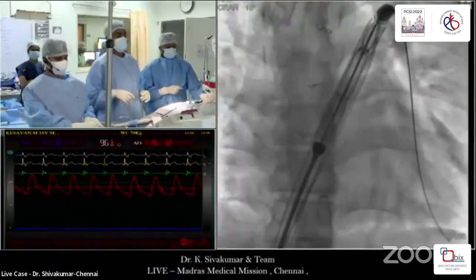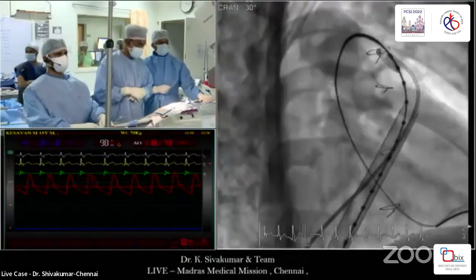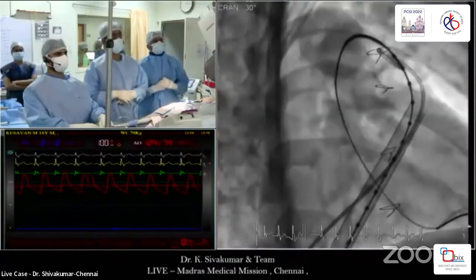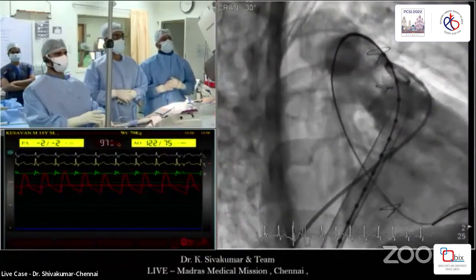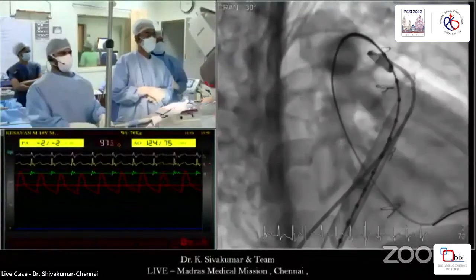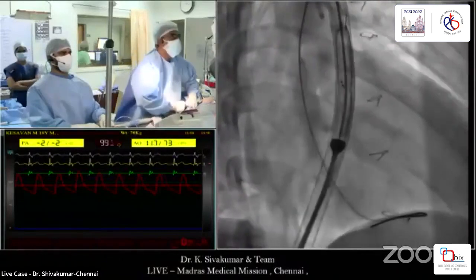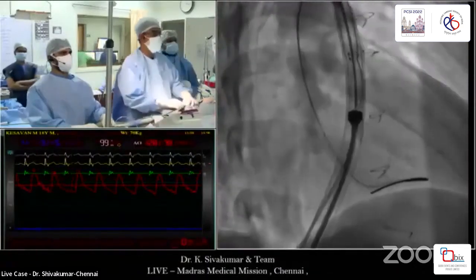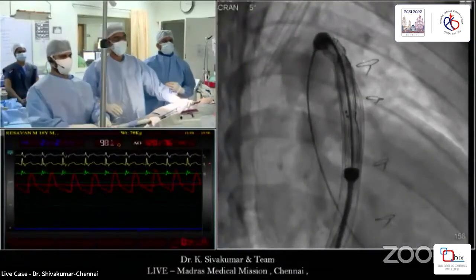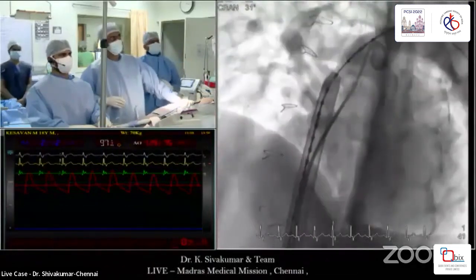Okay. So now come to RAO, please. RAO cranial. Show that RAO picture once again. Yeah, keep running it. Maybe LAO, show LAO because it's not separating it out. Show the LAO picture and get me the LAO 30.